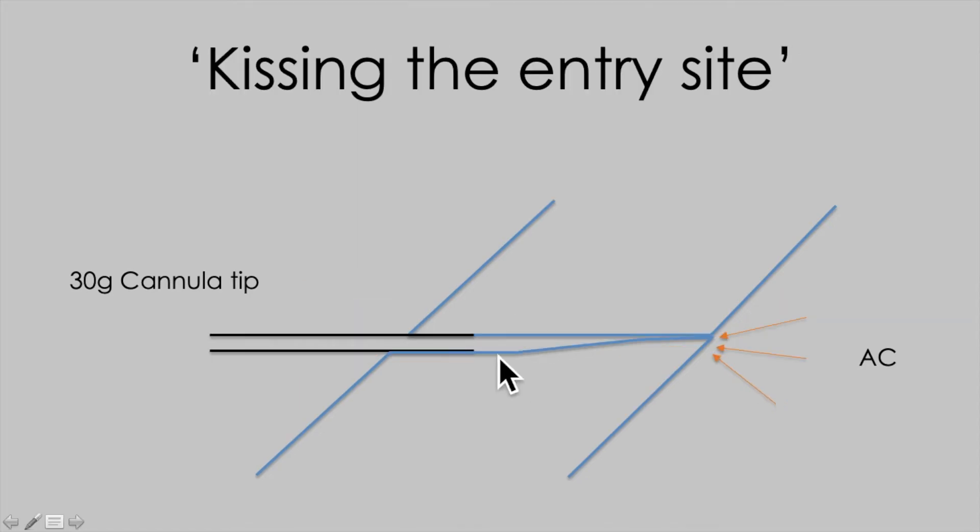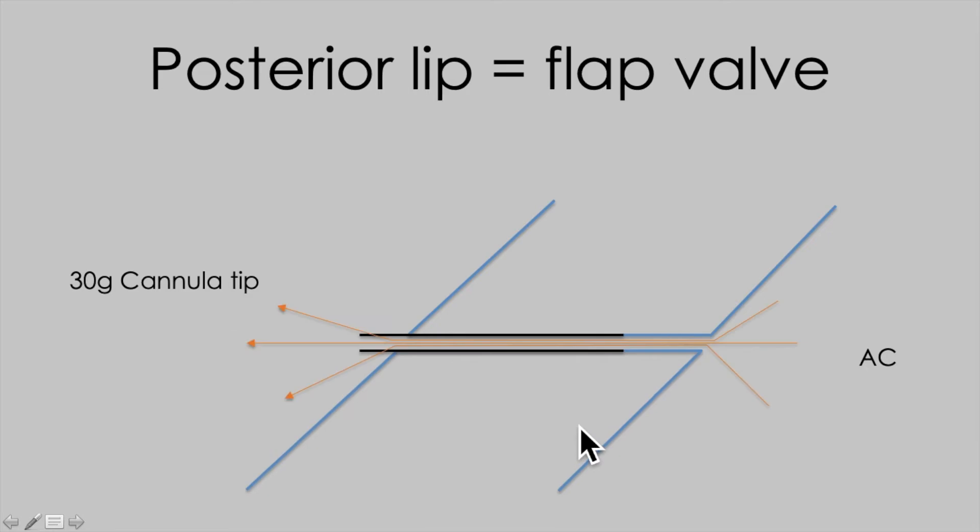What we're looking for is a real light touch — just entering the external 10-20%, or what I call just kissing the entry site, to allow the posterior lip of the cornea to act as a valve, and then advancing into the paracentesis if we want controlled flow around the cannula to the outside.